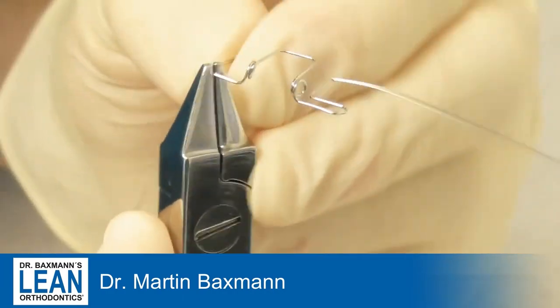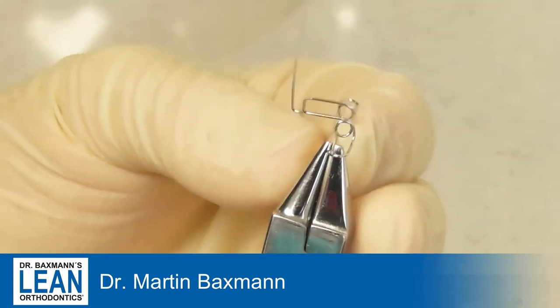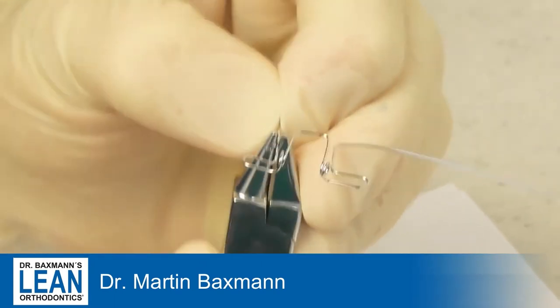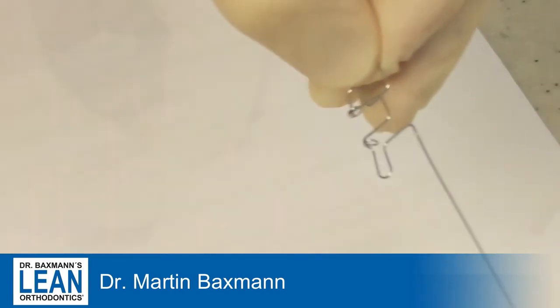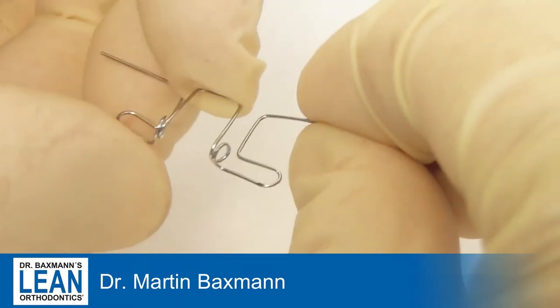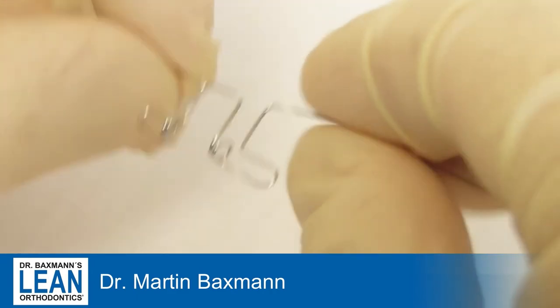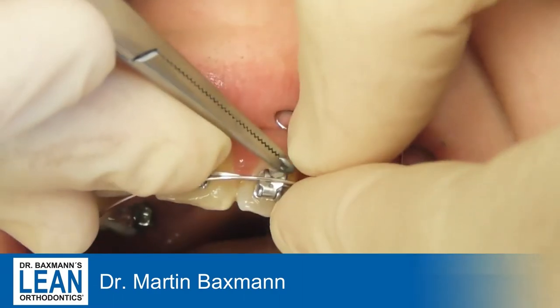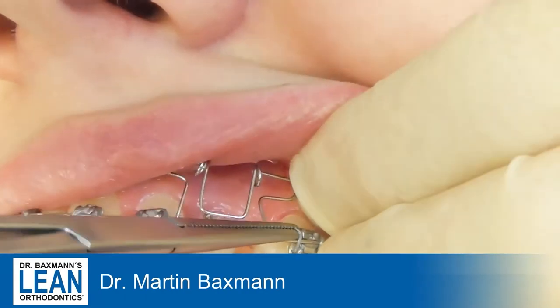Now you need the second part of the T-loop to mirror the first one. You do exactly the same as before and then you will have an end that will go into a bracket slot. We can push and pull with the T-loop and we have a little spring made of two helices. We're going to intrude it and move it buccally at the same time so we will be able to get it out of the crossbite.